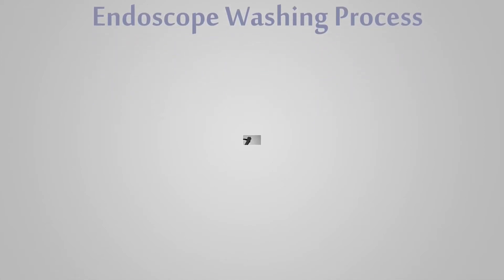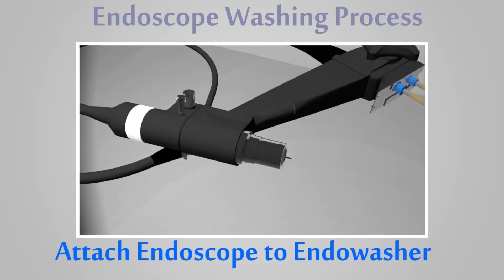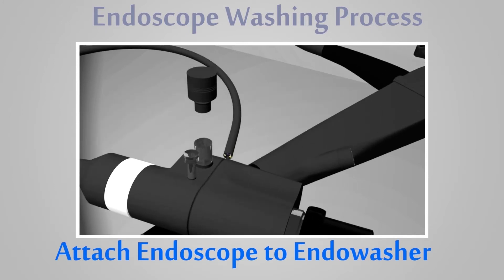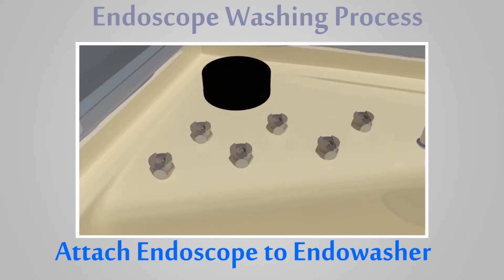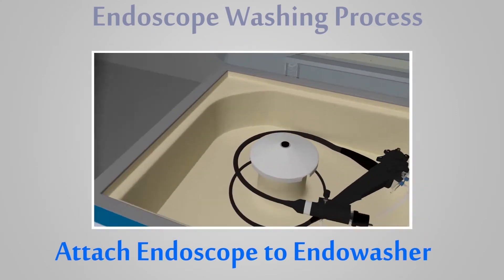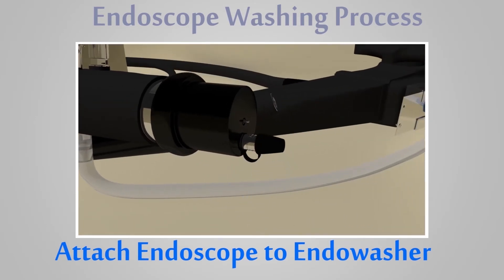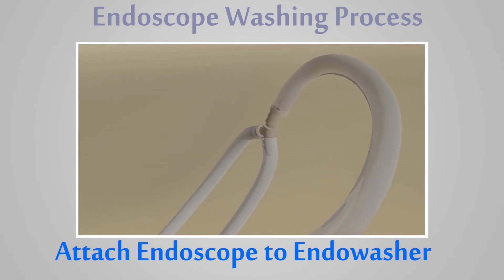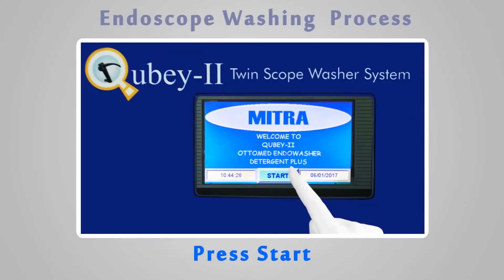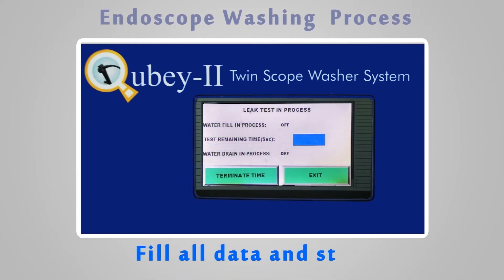Endoscope washing process: attach the endoscope to the EndoWash system. Press Start, select auto mode, fill in all data, and start.